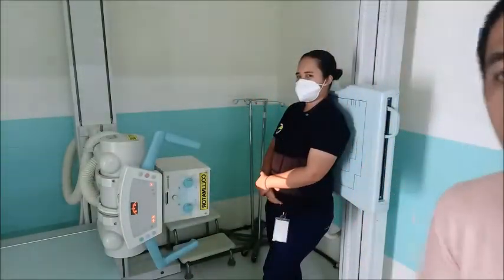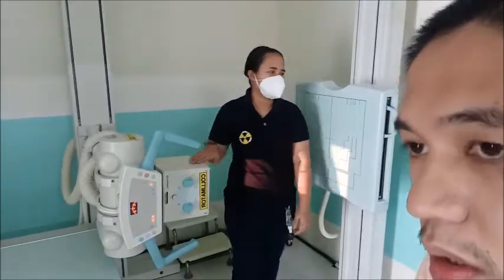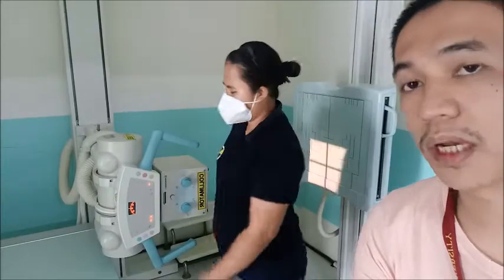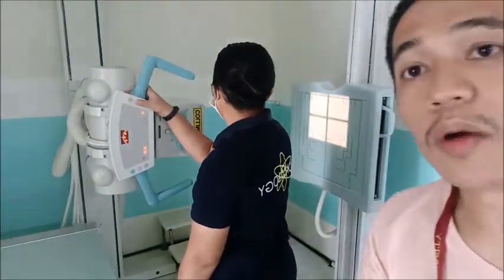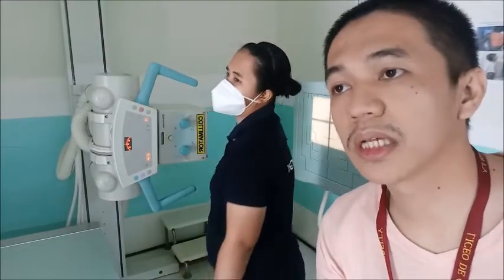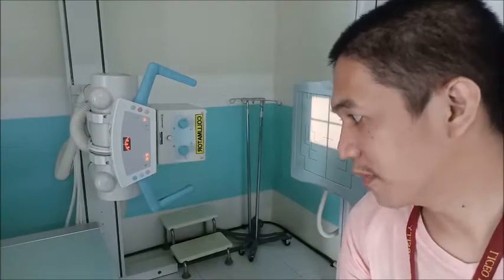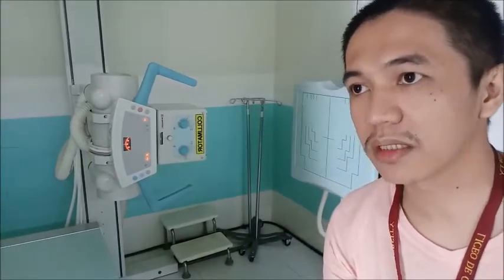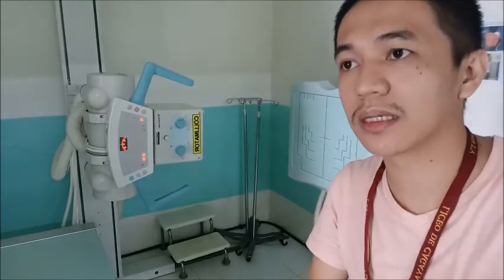Okay. So question, a common question of yours during your clinical setups and clinical rotation: what if the patient is trauma? Can you do a chest PA? Okay, so it depends on the trauma. If it is a stab wound, you can do a chest PA as long as the knife is not in front, and then the instruction would be different.